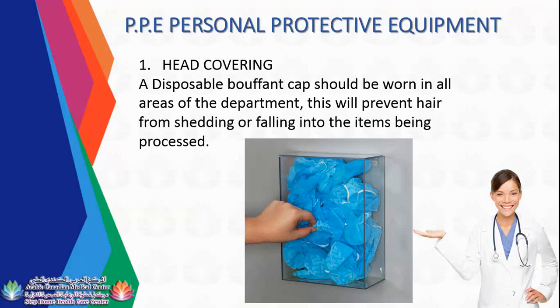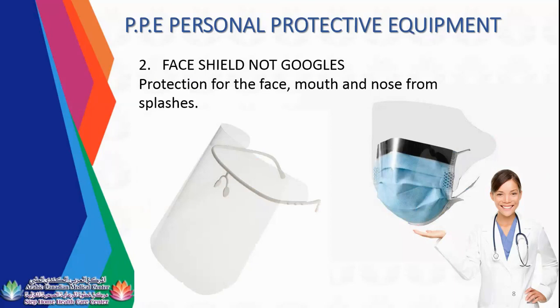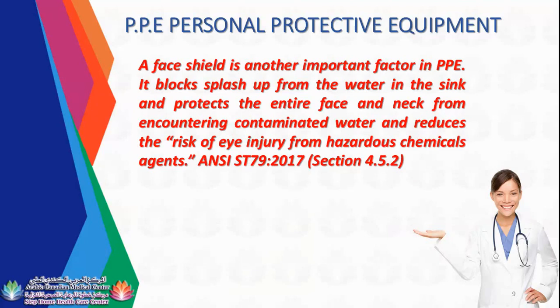Face shield, not goggles. Before it was goggles, now it's face shields. It protects the face, mouth, and nose from splashes. So you are protecting yourself from allergic chemicals and, at the same time, infectious or contaminated water. A face shield is another important factor in PPE. It blocks splash-up from the water in the sink and protects the entire face and neck from encountering contaminated water, and reduces the risk of eye injury from hazardous chemical agents.